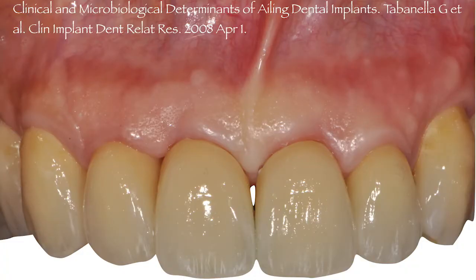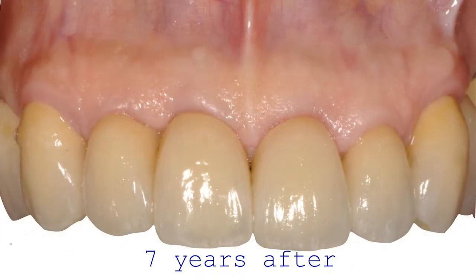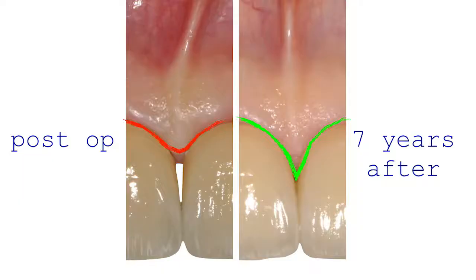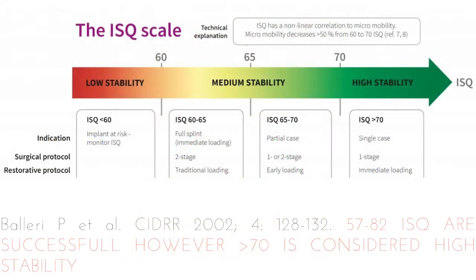Then at the end, we would like to achieve biomimetics, meaning something that resembles Mother Nature, and maybe see these cases improving over time. So when there is a nice even blending and harmonization of bone, soft tissue, implants, and natural dentition. We do know from periodontal principles that we can achieve, for example, creeping attachment and give the illusion of the papilla because there is no papilla between two implants. But everything is supported by the bone architecture that was reconstructed before. And we can achieve this on a very predictable base, and we can calculate this by using also digital tools.